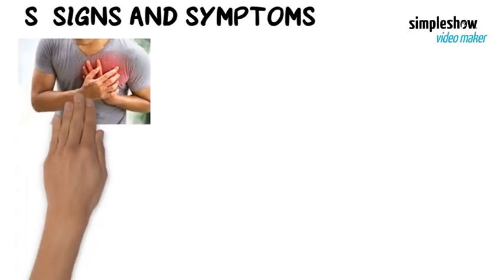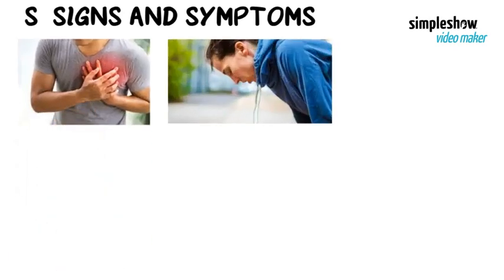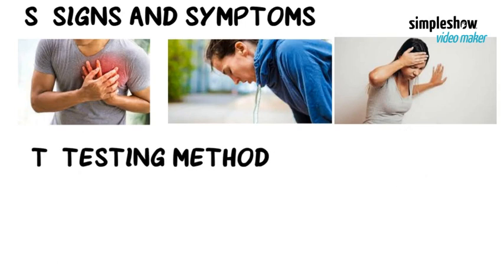S. Signs and symptoms. The patient's signs and symptoms of angina or other cardiac-related issues are evaluated before and during the stress test. These may include chest pain, shortness of breath, fatigue, or dizziness.